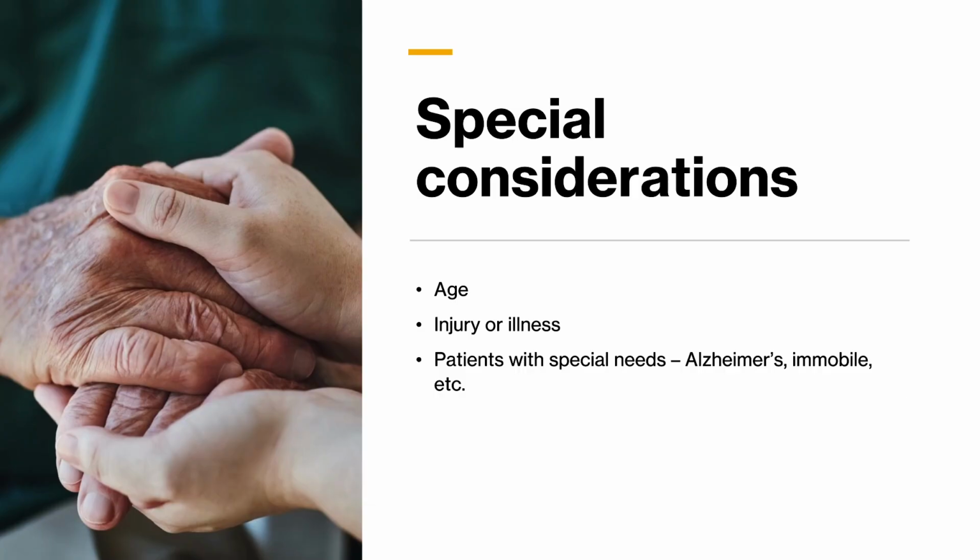But there are a million ways to do different types of x-rays. Some of these that we'll be learning, like the chest x-rays, you'll be doing a lot in patients that are, if you're working in a hospital setting, coming in through the emergency room, and you might not be able to do a perfect PA chest x-ray with inspiration because they're coming in short of breath and not exactly in the best mental state because of that. So there are different ways that we can modify our procedures to still get the best diagnostic quality possible, but also keep those patient considerations in the back of your head.